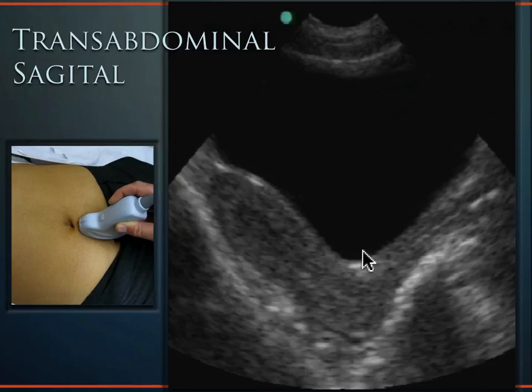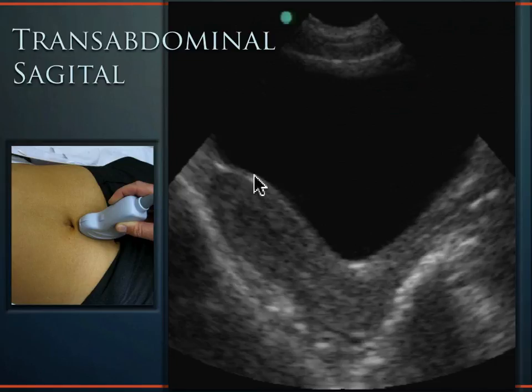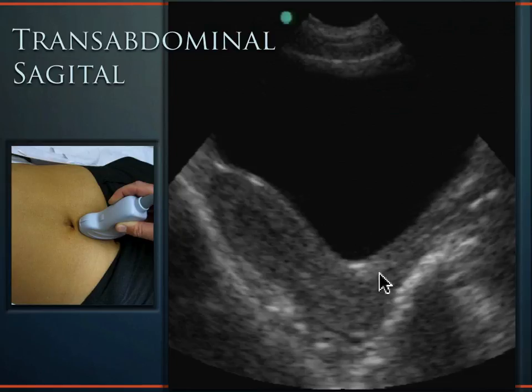On transabdominal sagittal ultrasound, the bladder looks very triangular-shaped. The fundus of the uterus is seen anteriorly, the cervix is below, and the vaginal stripe — a hyperechoic line — is visible below the cervix. The vaginal stripe represents the walls of the empty vagina collapsed on itself. Think of the uterus as lightbulb-shaped: the fundus is the glass bulb and the cervix is where you screw it in.